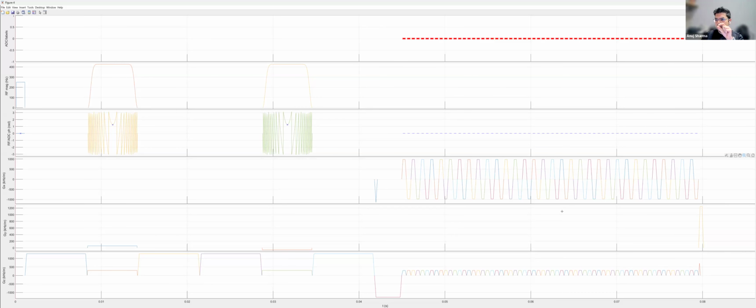But in Pulseq, I think as soon as you do add, like seq.addBlock, time moves forward, right? So imagine that I'm doing this in Pulseq and I add this first lobe here, first readout lobe, and I do seq.addBlock. As soon as I do that, time has moved forward to the end of this gradient. And now I can't add a flat GZ that is starting from the first gradient. I've tried several shortcuts. I've tried adding a negative delay. So what I would do is I would add all my readout bipolar gradients and do a negative delay on a flat GZ, but then that doesn't work well. It looks okay, but it doesn't work well.